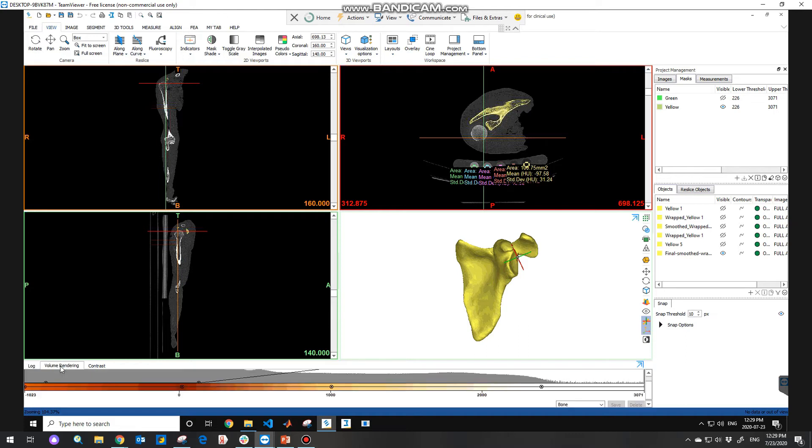In the volume rendering tab, we can modulate the windowing of our images. You can do this by manually dragging one point to another point like this.